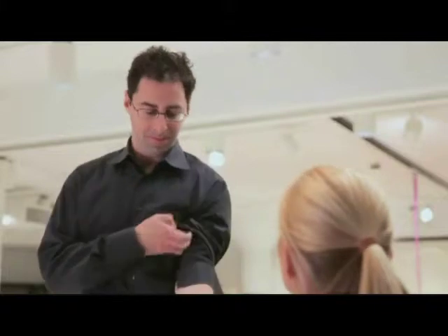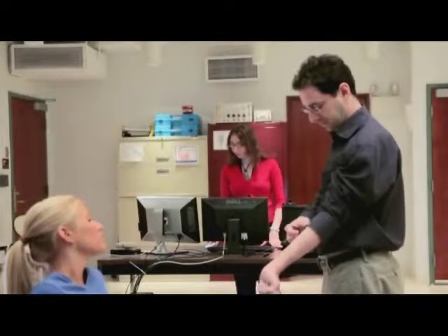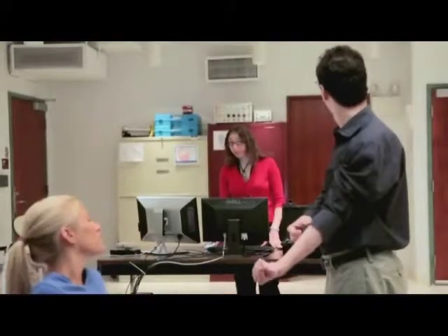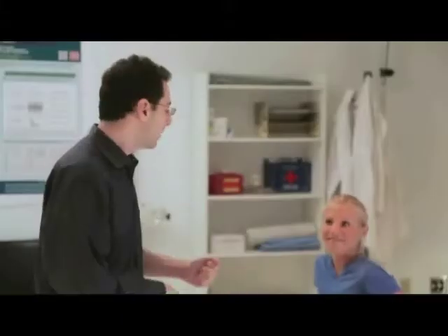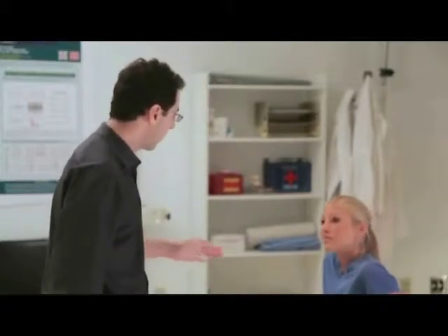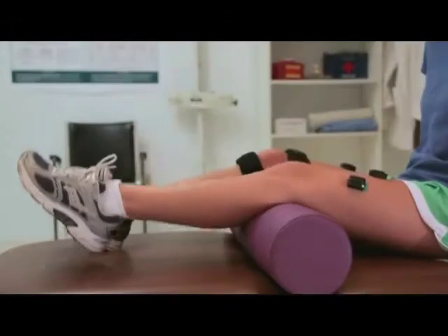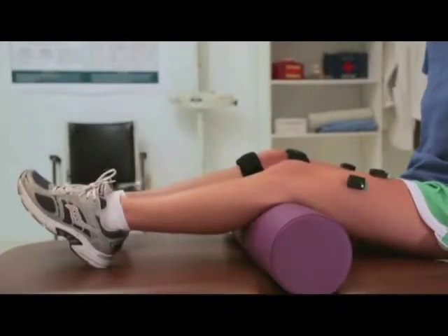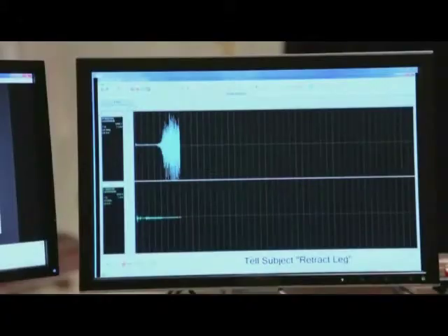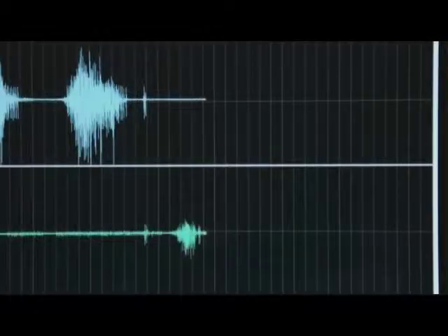Dr. Walker tests the system on Monica and confirms the signals look good. He initiates a comparative measurement, explaining they will repeat the same motions on each leg one at a time. Monica is asked to extend her healthy knee. Monica's healthy muscle activity looks very smooth and rich compared to the sporadic activity detected from the injured leg.